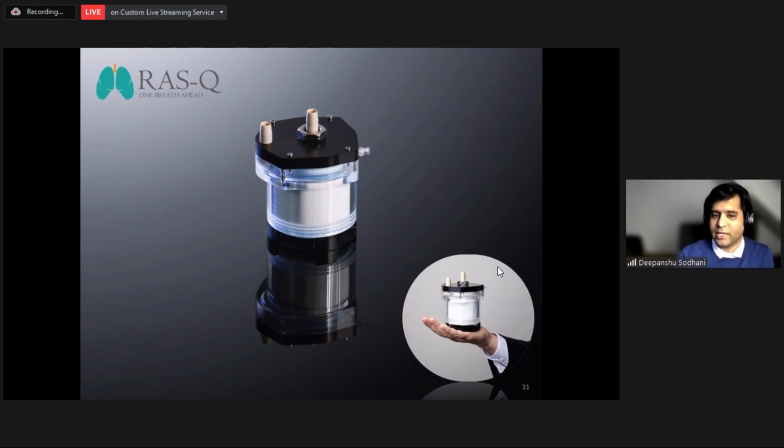In our case, this is one example that we are showing. We are now also considering double chamber systems, but in the end, they're all either wound or layered, because that's the best possibility that we have with these PMP fibers. I hope that answers your question.